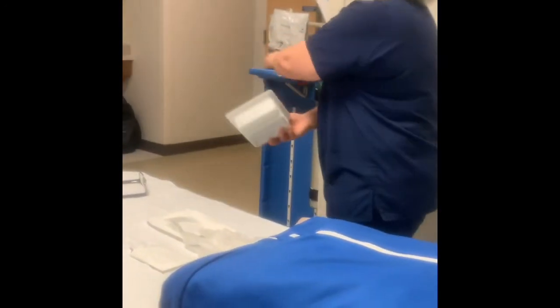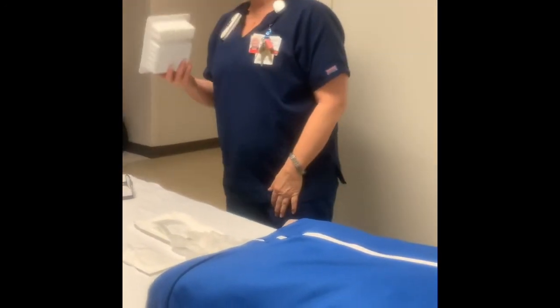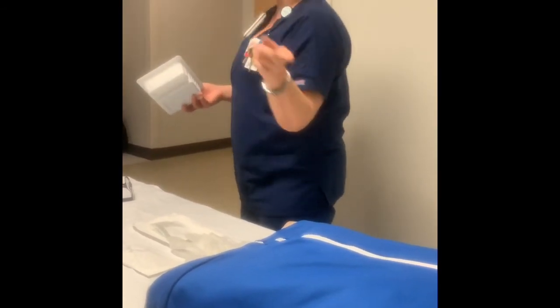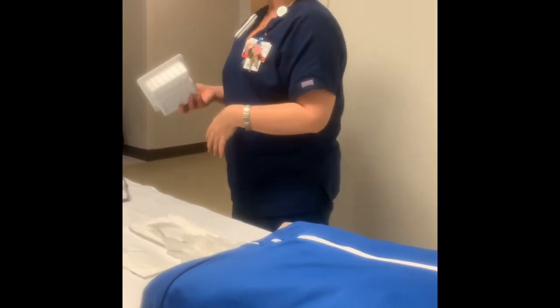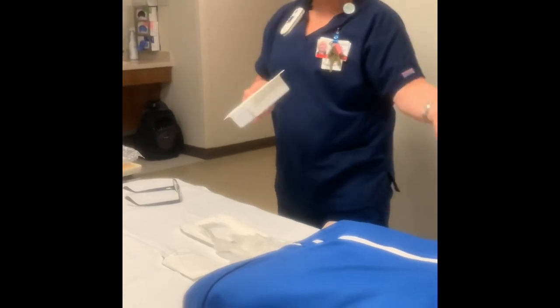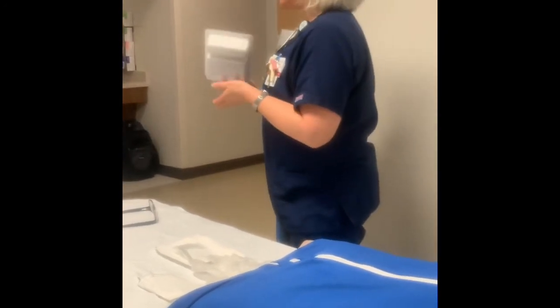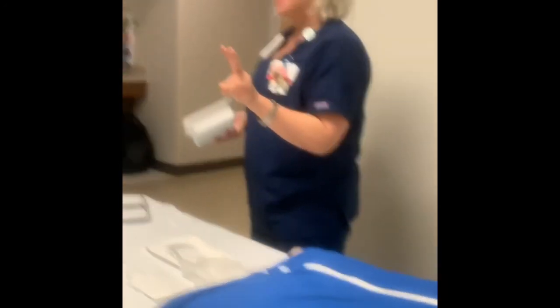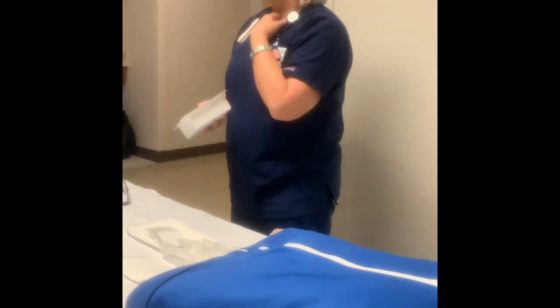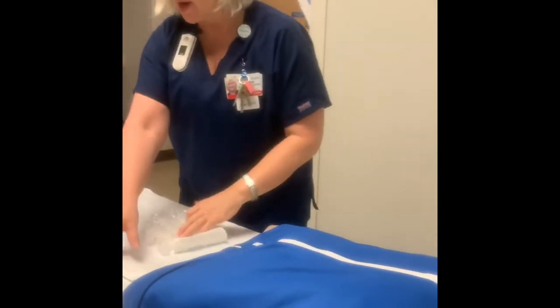The one thing here at Banner Gateway, it's both nurse and respiratory that takes ownership of trach. In the other facilities, a lot of times it's respiratory, and in some other facilities it's nursing. It's pretty well spelled out in the policy, but at Gateway, it's a shared responsibility twice a day. It has to be done, or more frequently if it's soiled. Remember, you want to keep those crusts out of there because they can flip over into there and then they can get pneumonia. And then you've got a lot of other problems.